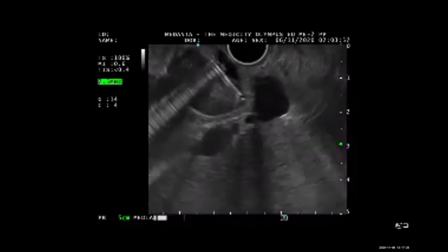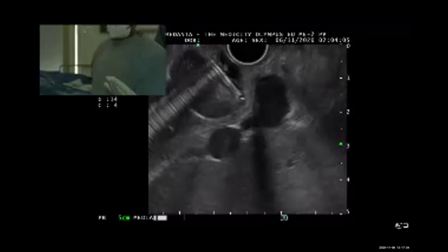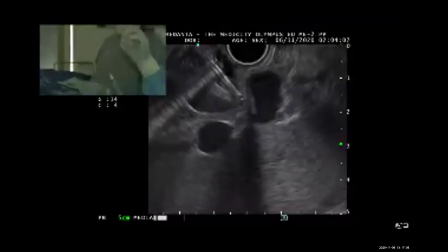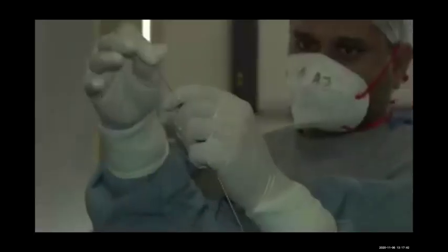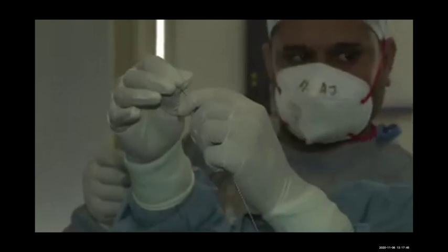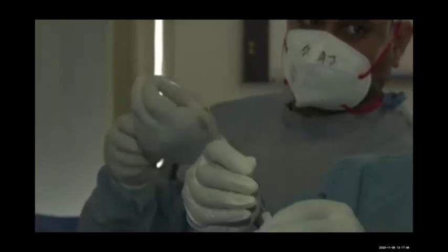Now, you focus here on the hand. Bhagwan, show the step, or can you guide us how to do it? So, this coil should be fixed here. Now, may I introduce the stylet? Can we have the enlarged view of the hand, please? And can we see the tip where the coil is? Yes. Then you show the fluoro also. Fluoro is also visible, you will see.